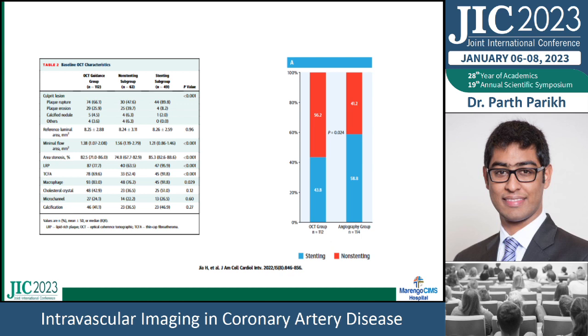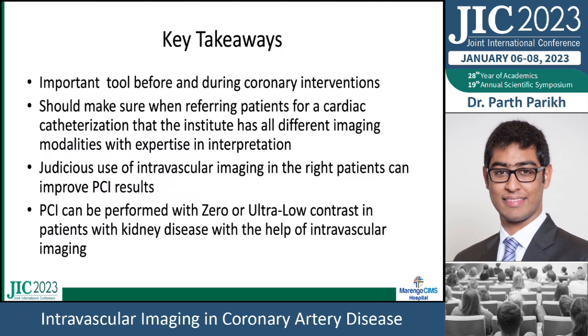And just to show that you can still be okay, and just using intravascular imaging does not mean that you will end up with additional stents. So key takeaways here is that it's an important tool before and during coronary interventions.